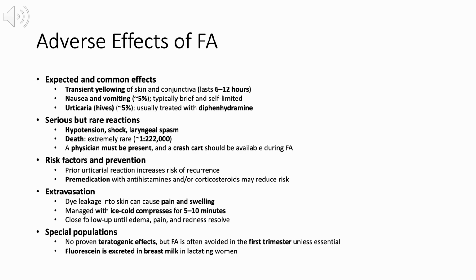Special populations also warrant consideration. Although no proven teratogenic effects have been identified, fluorescein angiography is often avoided during the first trimester of pregnancy unless essential. In addition, fluorescein is excreted in breast milk, which should be considered when imaging lactating patients.